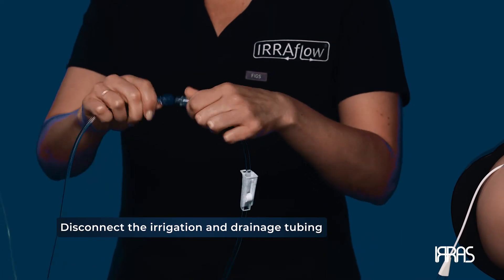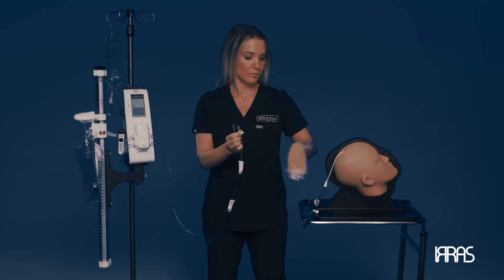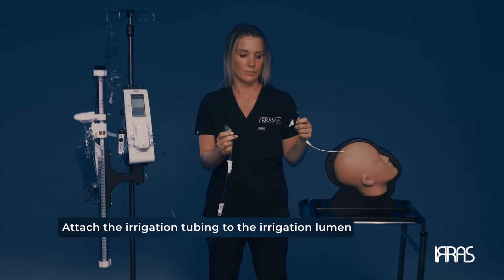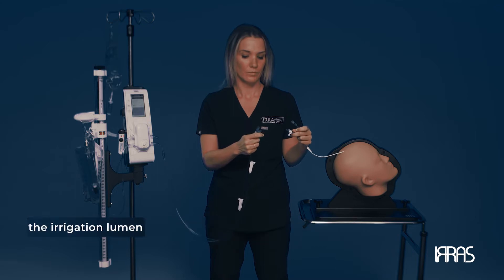First, you'll need to disconnect the Irrigation and Drainage tubing that was connected during system priming. Once that step is complete, attach the Irrigation tubing to the Irrigation lumen on the catheter.